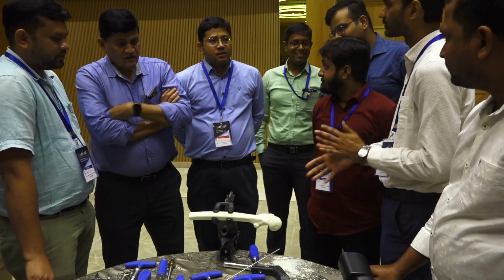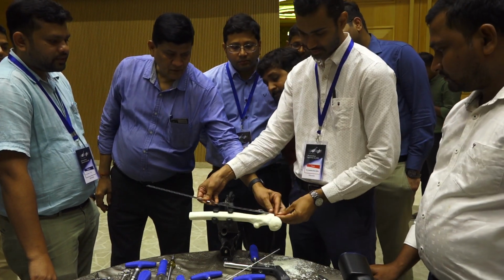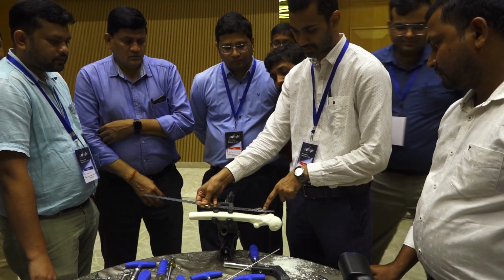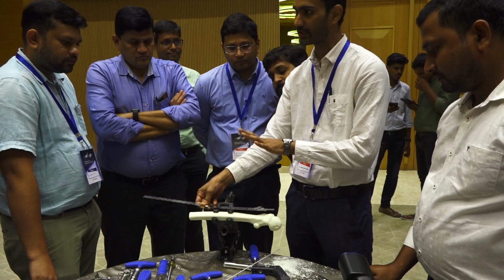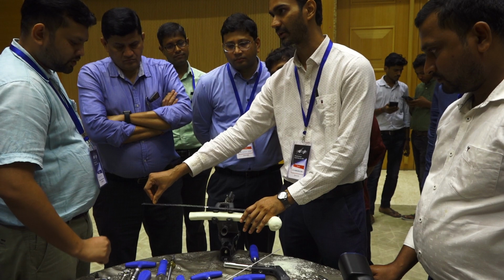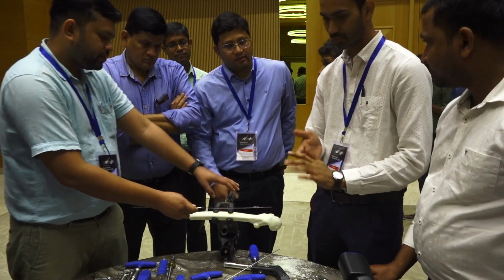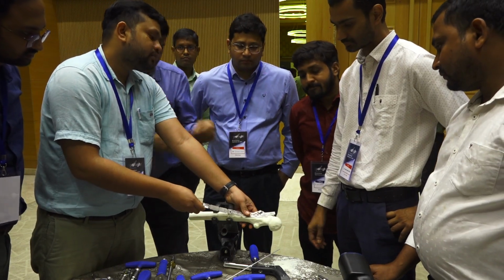So this should match to the tip of the nail end. This is the marker for different 125, 130, 135 degree nails, but usually a 130 degree nail is good enough. Okay, and then you check the upper pole of the patella. Here we have only the 130. Whether we should keep it on the tip or in the center of the neck.